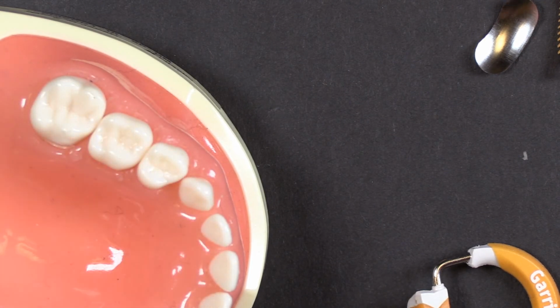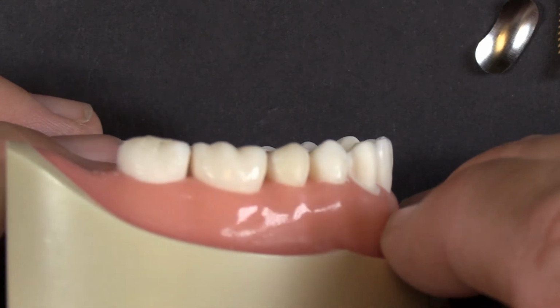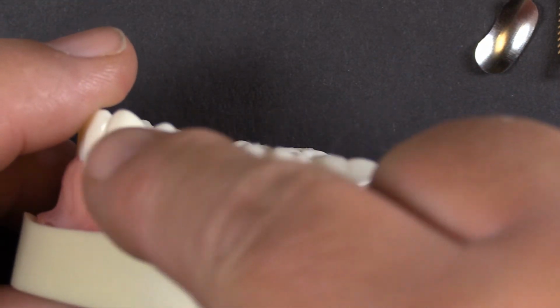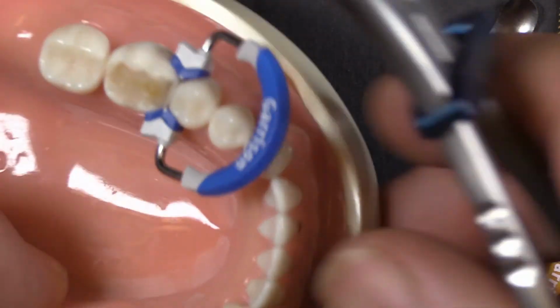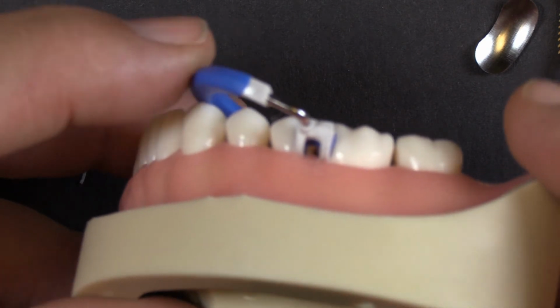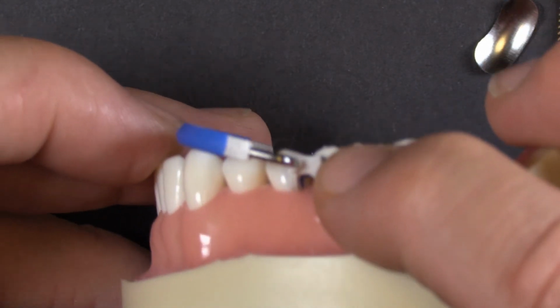And the 3-prong pliers come into play potentially when you're dealing with the curve of Spee. So we've got a lower here, and this is a pretty ideal model, so it's not as aggressive. Sometimes this can, of course, be really curved in here, but I think it's good enough to show what our one person was asking. So they're coming in, they're placing this, and let me flip it around. And you can see on this ideal model, it's right tight down against that tooth, but the tine is resting in a good position.